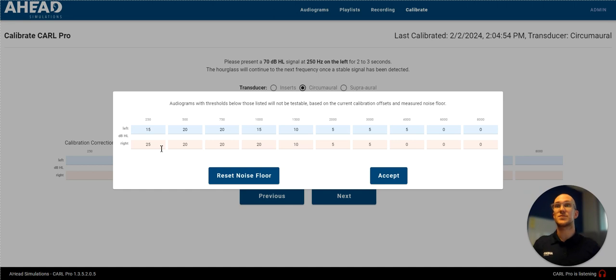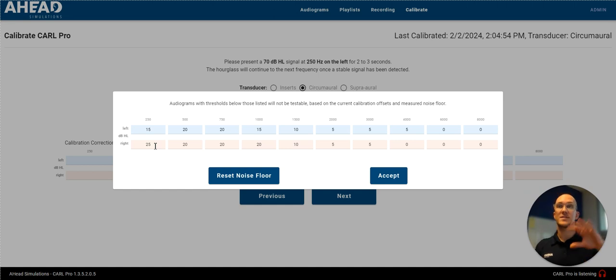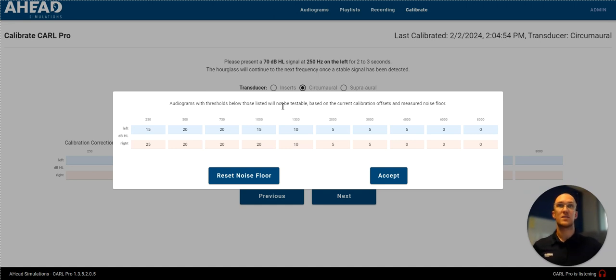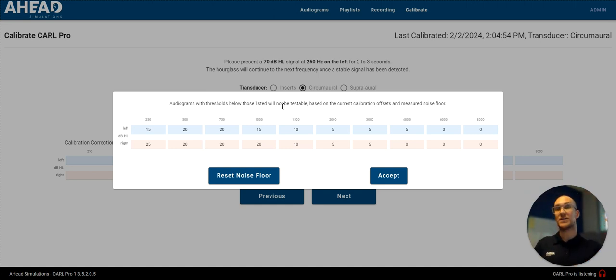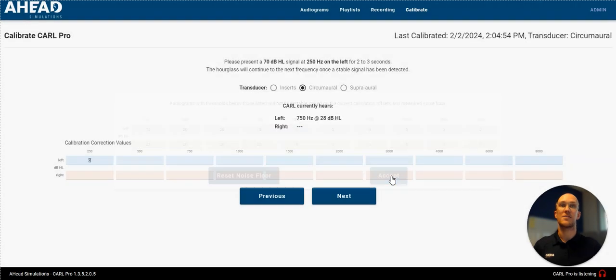And this will be saved inside the software so that it can make any corrections that it needs. And this is also to know that any audiograms that have a more mild hearing loss than the thresholds that you see here, Carl is not going to respond effectively in those regions. So as you could imagine, once you're in a more quiet environment, these values will decrease. If you're in a louder environment, then they will be higher.